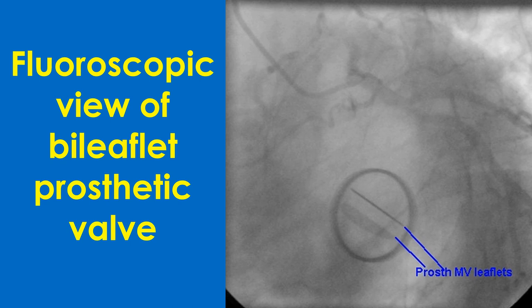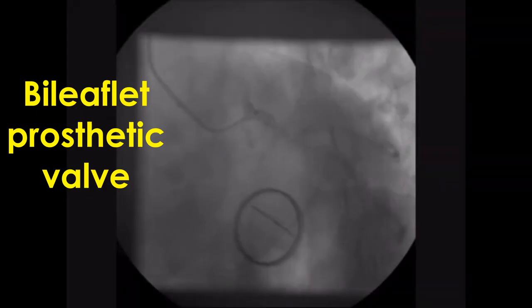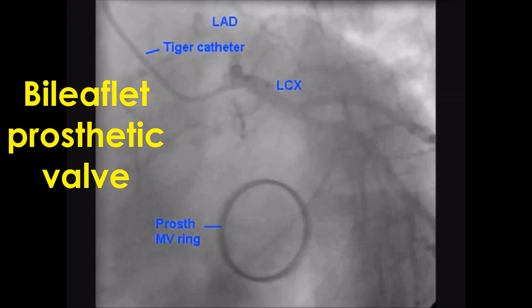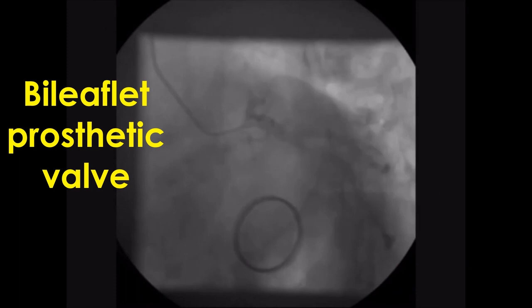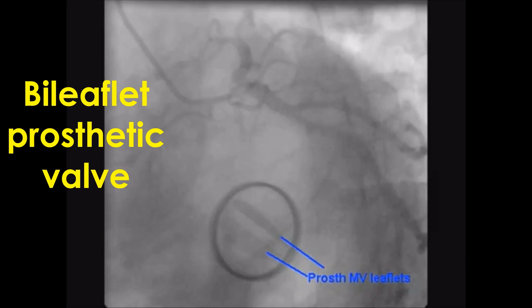St. Jude Medical and Carbomedics bi-leaflet valves have slightly different characteristics but both have similar clinical performances. Medtronic Hall is a single leaflet valve. Onyx is a newer bi-leaflet valve which has been approved for lesser Warfarin requirements in the aortic position. The ring of the prosthetic mitral valve is seen here, with the leaflets opening and closing. Two leaflets are seen in this view.